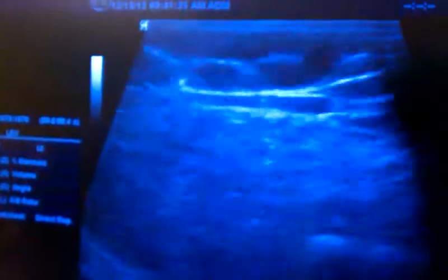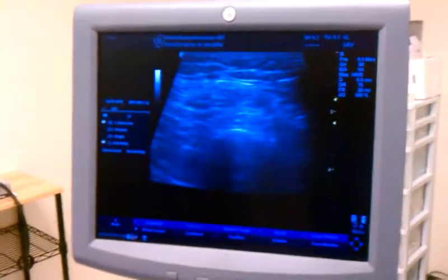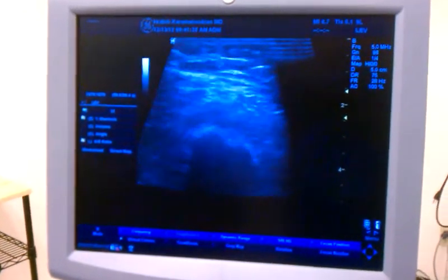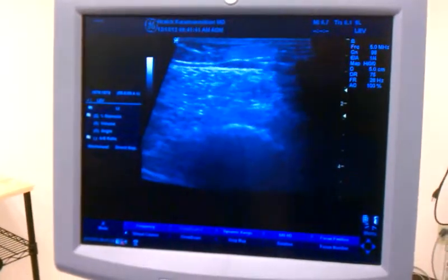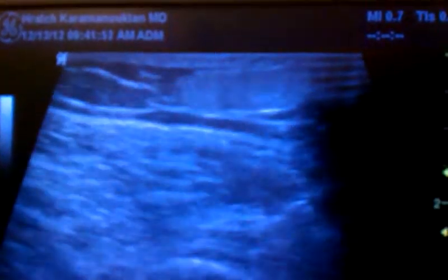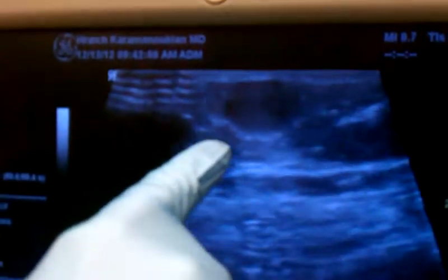Here they are. We'll need some more here in the lower thigh. So this is foam sclerotherapy, or ultrasound-guided foam sclerotherapy, in a 76-year-old patient who has a huge anterolateral branch of the great saphenous vein and varicose veins extending over the kneecap and down to the medial aspect of the leg. You can see sclerosing foam in there moving around. I'm pushing on the vein now — see that? All that is foam in the branches.